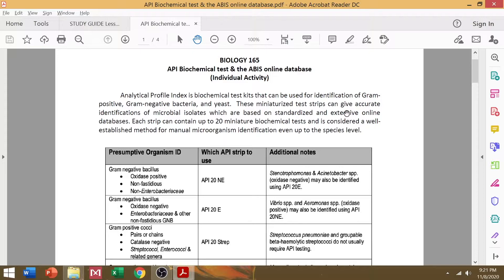So, this method of identification provides a standardized miniaturized version of the existing biochemical test in the lab. Each test strip contains chamber with dehydrated media that is usually able to detect the enzymatic activity of the inoculated organism, your microbial isolates. Bacterial suspension is usually inoculated in each of these chambers in the test strip and is incubated overnight within the 24-hour period at 36 degrees Celsius. This incubation period allows for the metabolic activity of the isolates to produce certain colorimetric changes in the interaction chamber.